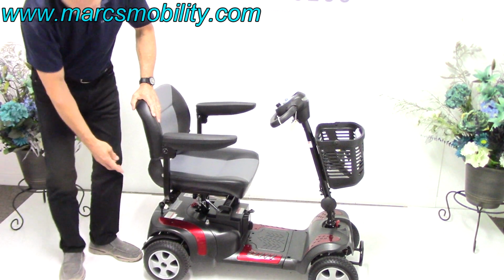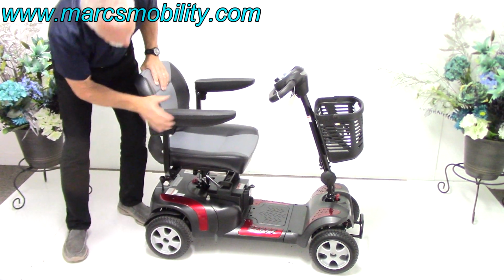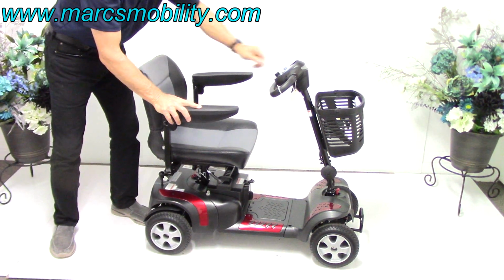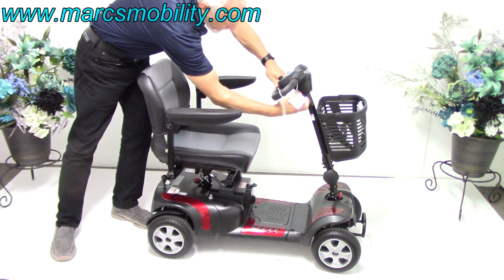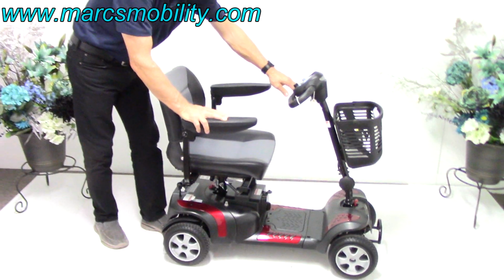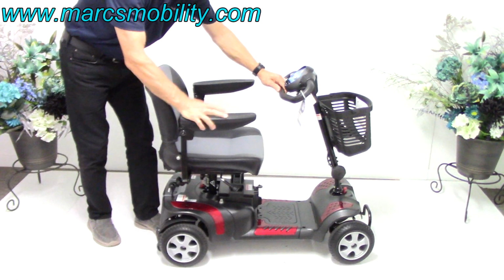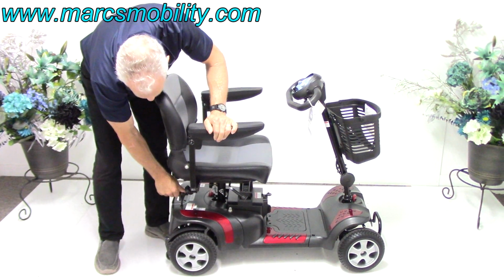You've also got a lever back here. That's your neutral. If I lift this up, you see how hard it is? Make sure your key is off. Always turn your key off, and look at the difference. Look at this. The key was on, so you can roll it around in neutral. But make sure you always put it back in gear.